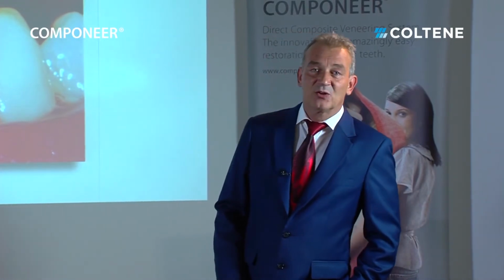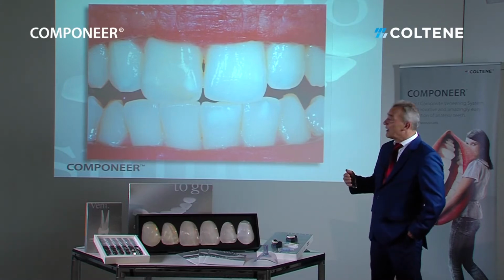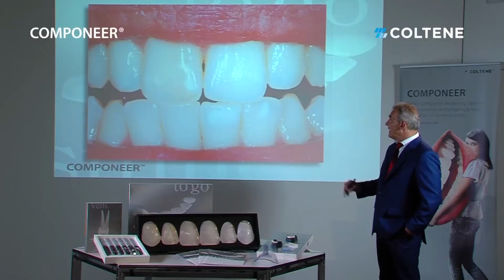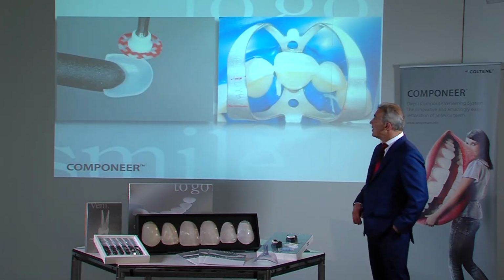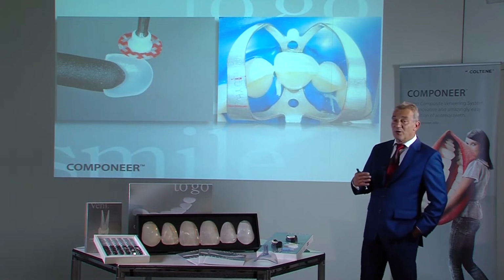Individual teeth or individual groups of teeth. As we learned in the basic course, individual teeth can also be restored with Componeer. If the restoration is not major, then it certainly makes sense to adapt the Componeer as closely as possible to the preparation to achieve an excellent fit.